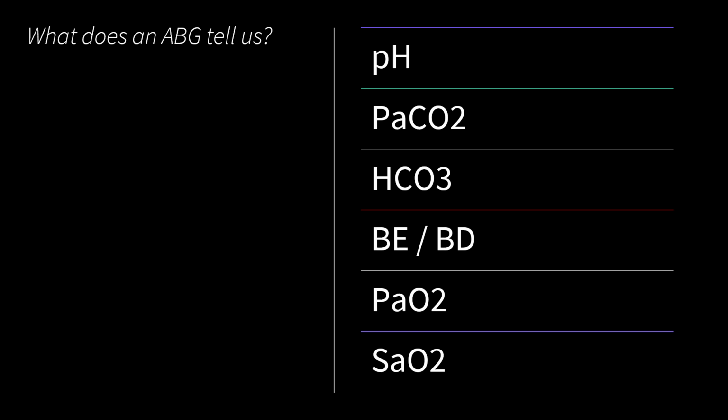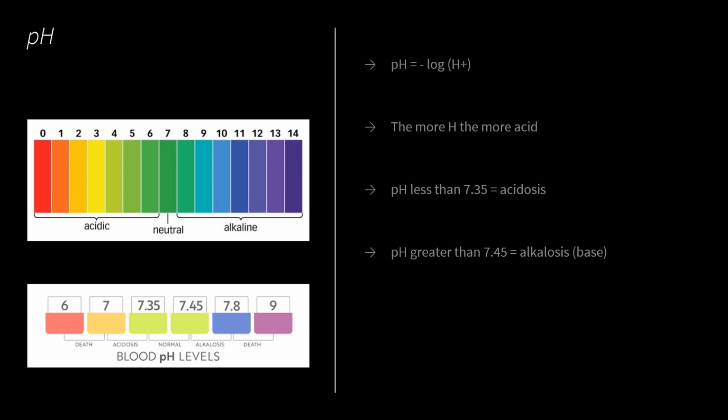Right, so the ABG tells us two big chunks of information. It gives us a very accurate assessment of the patient's acid base, plus the compensation mechanisms involved. So it'll tell us what the actual pH of our patient is, and then what our compensation mechanisms are doing to either help, or if they're the causative element, or if they're both causing the acidotic or alkalotic state. And then the other chunk is going to be the oxygenation of the patient. So it'll give you direct sampling of the arterial blood to tell us the exact oxygen content in a very precise manner.